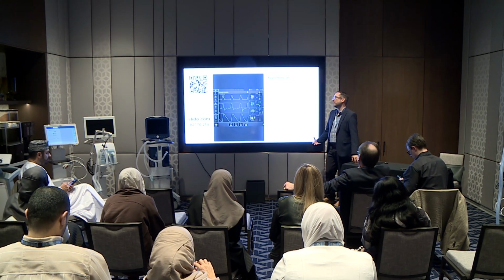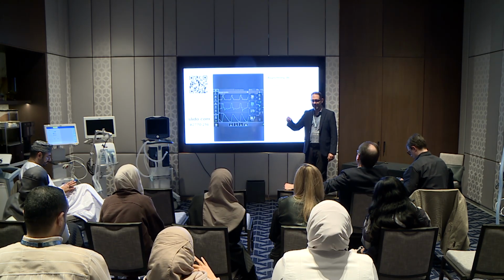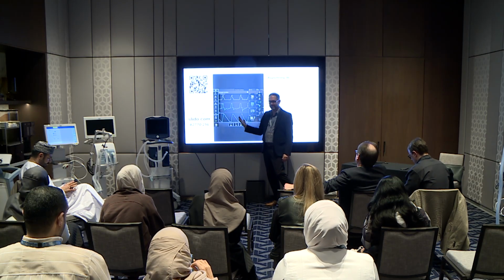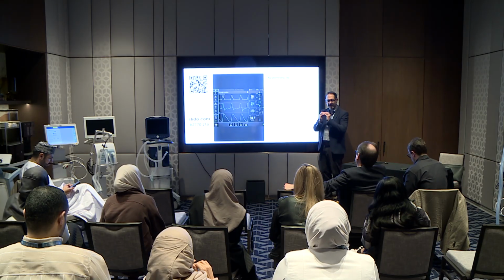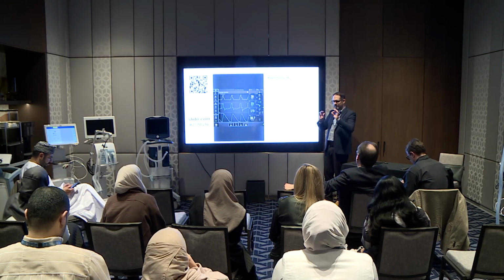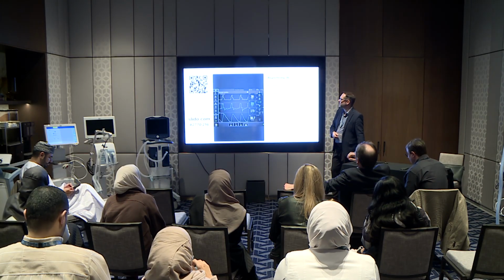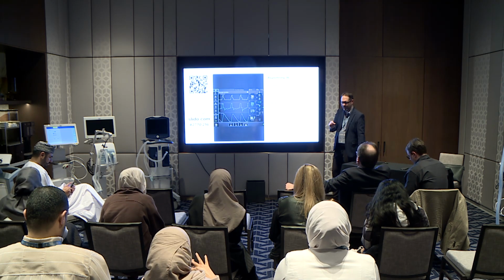And now, I will point out, early cycling, that post-inspiratory loading is something we see similar in this type of asynchrony. If they didn't trigger it, so I'm trying to really get you to focus on the, and I think it even says what's the most likely or the most specific form of asynchrony is this right here. That's why I was like, where are my descriptions? Because my descriptions hint whether I want you to focus in on one thing or not.